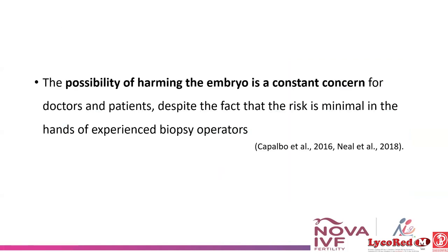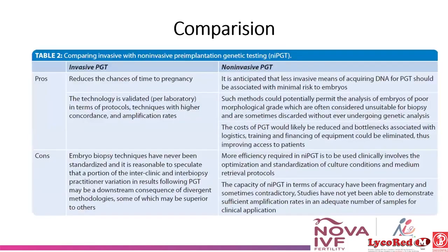There was literature saying that the possibility of harming the embryo is a constant concern for doctors and patients, despite the fact that the risk is minimal in the hands of an experienced biopsy operator. Though there are experienced biopsy operators, there is a chance that you will end up damaging the embryo, because we don't know what happened. What we experience when we do ICSI is that we can do ICSI even with closed eyes nowadays. But when we are doing the biopsy for each and every embryo, the biopsy technique is different, the control is different, so we have to take care during the biopsy.